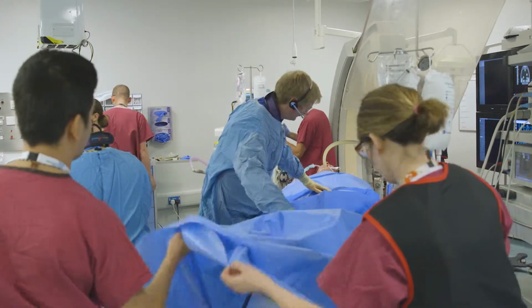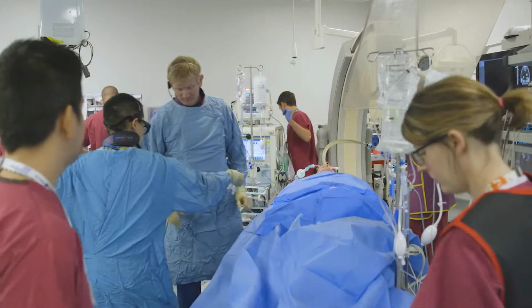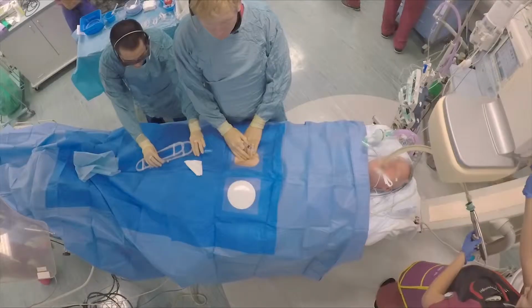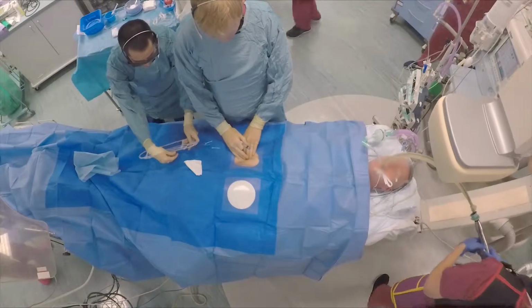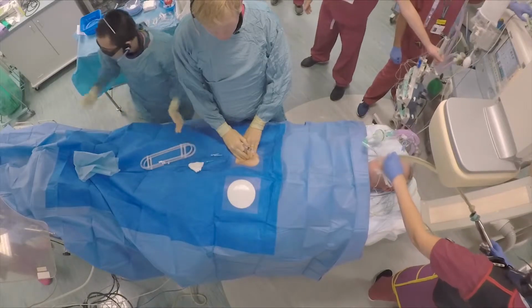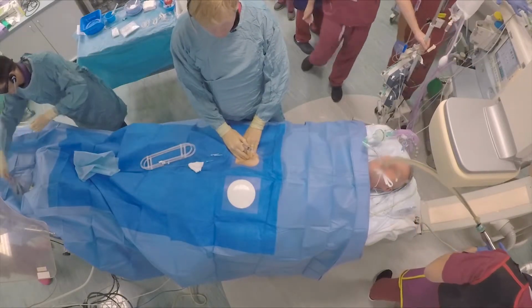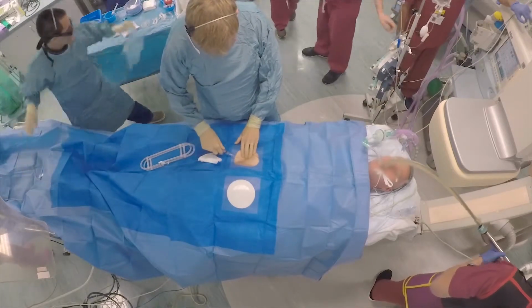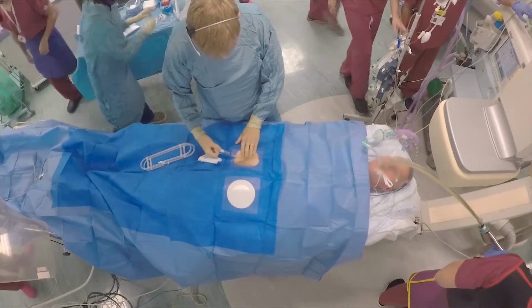the catheters will be passed to my clinical fellow to start getting that set up. We try to make sure that neither of us is not working at any point. Here you can see, just using standard anatomical landmarks in this slim patient, it is easy to gain vascular access.